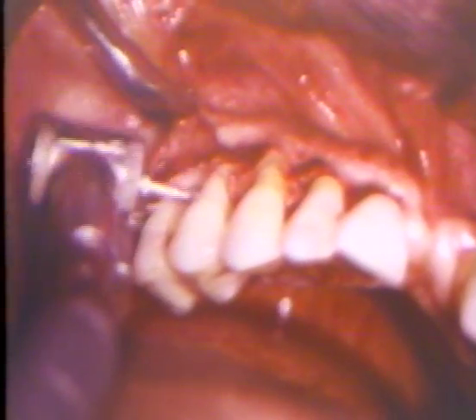Coarse diamonds are used for contouring. Be careful to use a water spray and place very little pressure on the osseous tissue. It is important to be careful of the tooth structure in the area so that gouges or irritants are not made in the tooth surface.